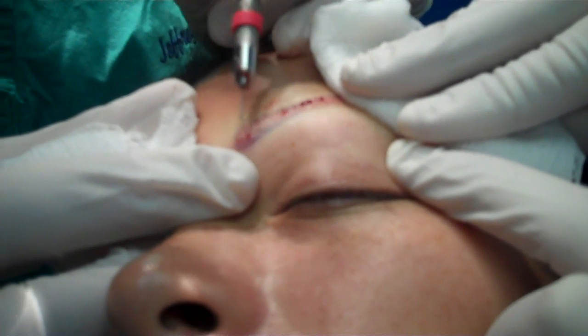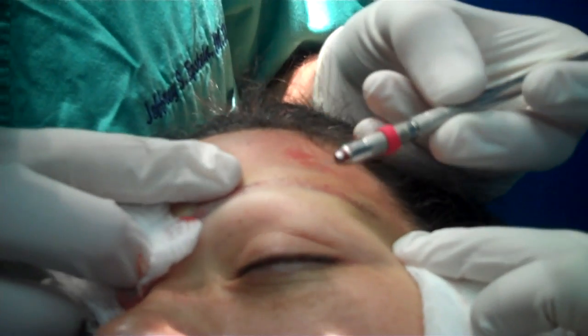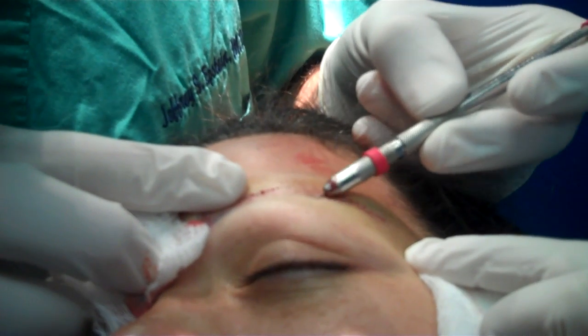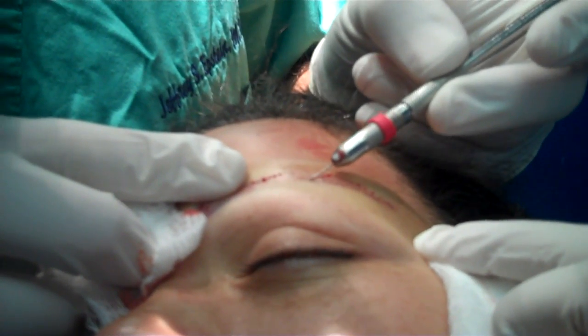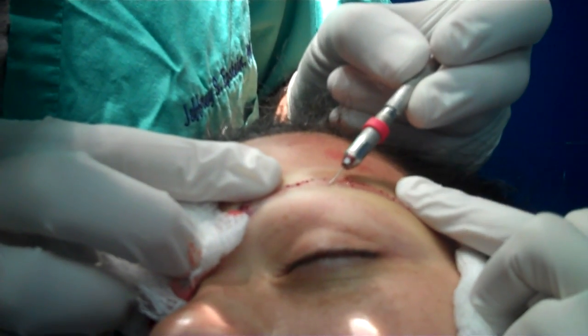In this area, they're growing almost directly vertical. I've already started making these, which are growing in an upward and lateral direction, and you can see once again staying very flat.